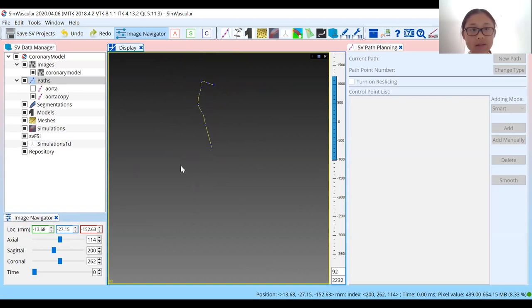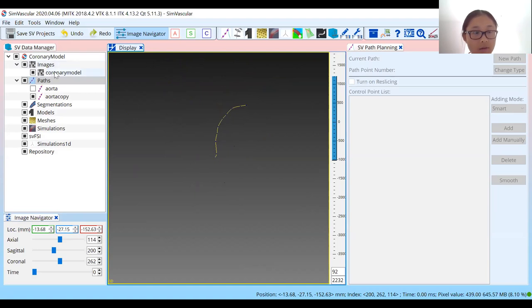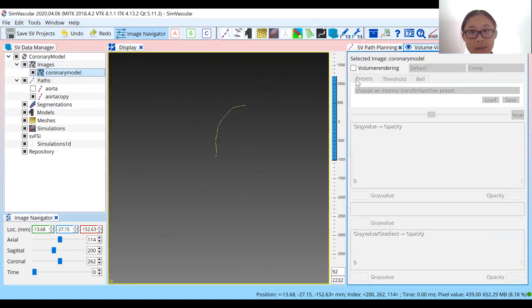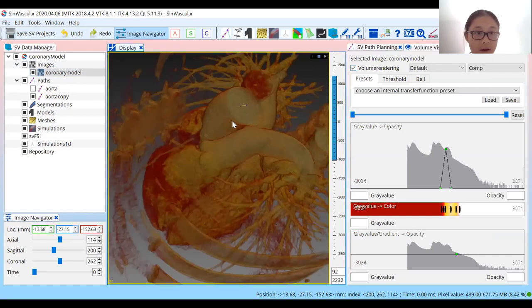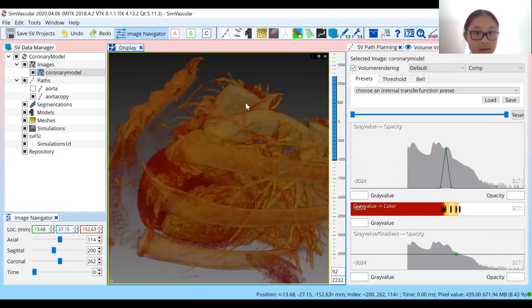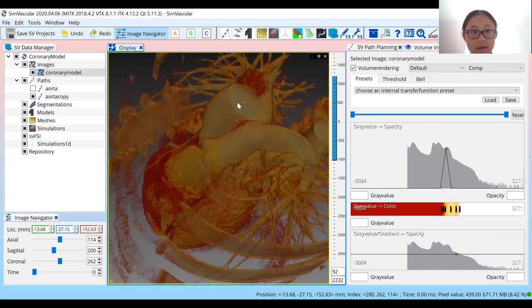Usually the aorta is pretty straightforward — it's just a curved line. If I turn on the volume rendering again, you'll see that this should follow the path. It goes through sort of the center of the aorta here.